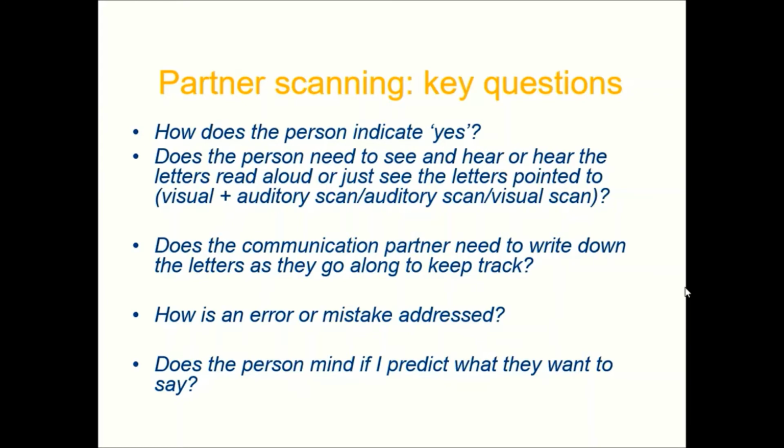As I mentioned, I really recommend that you write down the letters as you go along to keep track. If you think there's been a mistake or an error, how are you going to address that? I can usually tell if I've made a mistake or something's going wrong, and I'll just say, let's pause. I just need to ask, have I made a mistake? And they can indicate yes or no.